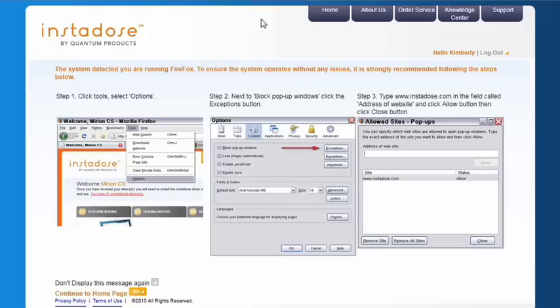We recommend using Chrome or Firefox. These browsers present the least interference with the installation and performance of reading the device. Some browsers require that you configure your settings to allow pop-ups to ensure system compatibility.